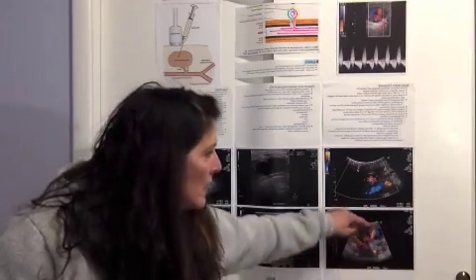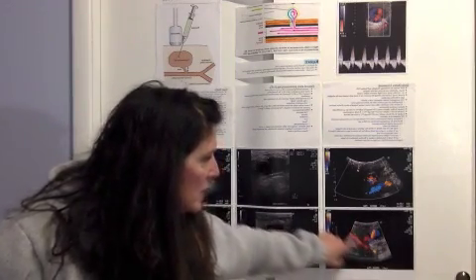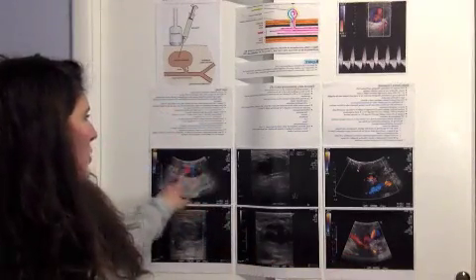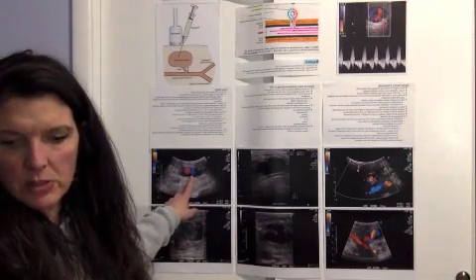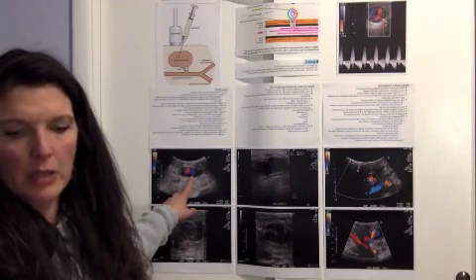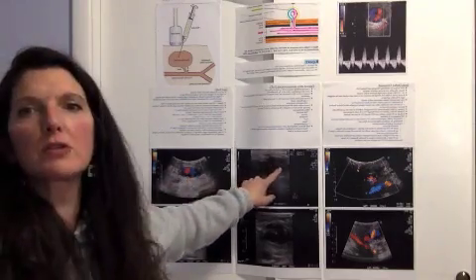You can see a smaller one and a larger one, and then the neck is here, and here is the adjacent artery, the femoral artery. We measured the largest lobe to be 2.5 by 2 centimeters, so that lobe was much bigger than the other of these 2 lobes.